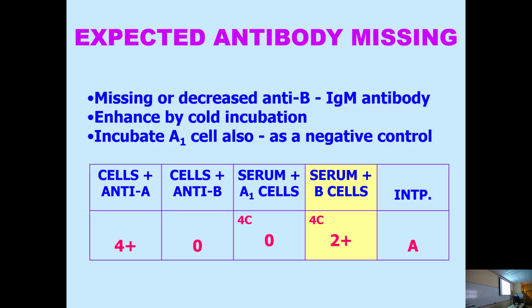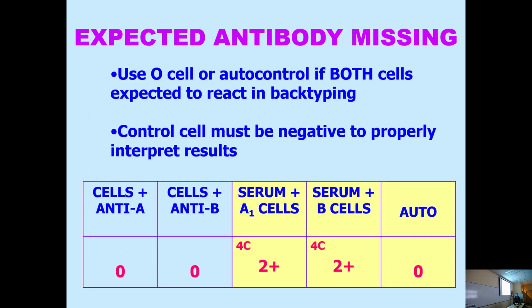So we not only identified it, we've resolved it. Resolving is only if you actually get it to work out to a number somehow. Okay, so that's what we're looking for, resolving. As I said, we're gonna run both of them because you want this one to stay negative. If this one does go positive, now you gotta look at what else is happening. So you can't just run one and hope it does what you want it to do.